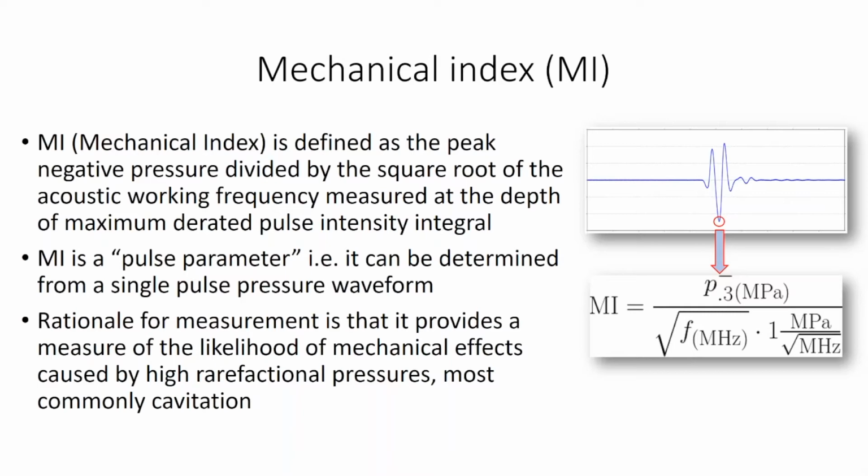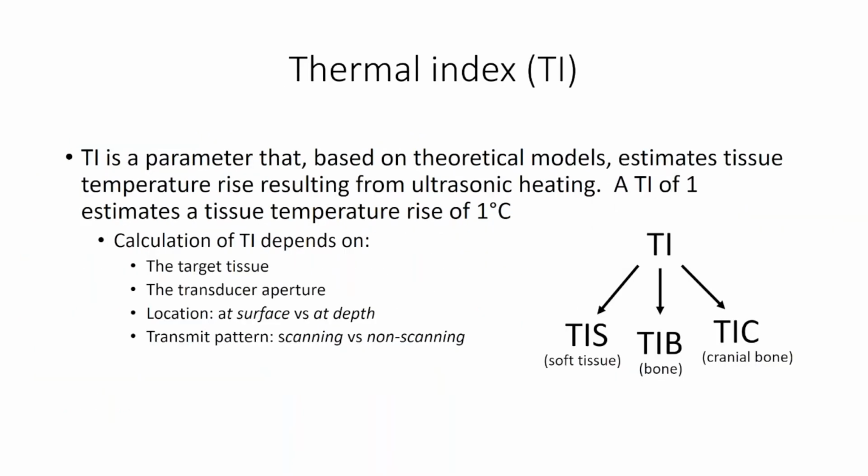It is worth noting also, relative to the harmonization of standards, that one of the significant impacts is by IEC 62359 becoming the primary standard defining the ODS, that now the mechanical index is searched throughout the entire near field, whereas the near field search was limited in the UD3, a prior standard.